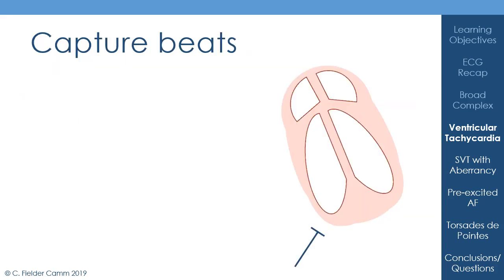So let's imagine we've got our lead looking somewhere around here, and it's seeing nothing at the moment, but then you've got a pacemaker cell and it fires off. And you can see that our lead is looking exactly where the pacemaker cells are, or that site of the ventricular tachycardia is. And so all of the depolarization is occurring away from it. So you get this deep S wave occurring. And then you have your T wave.